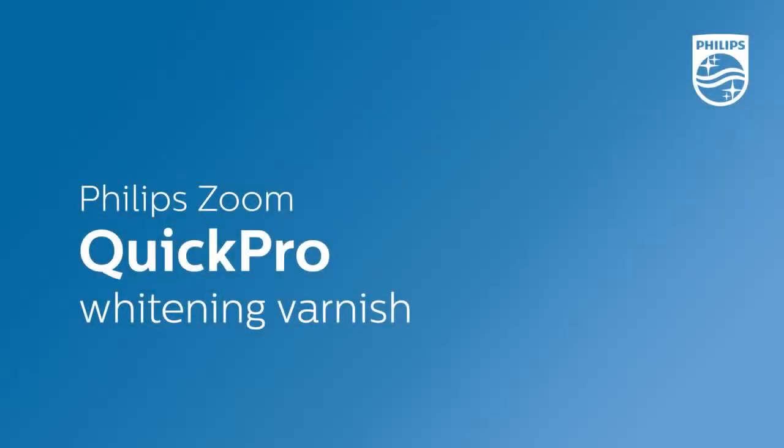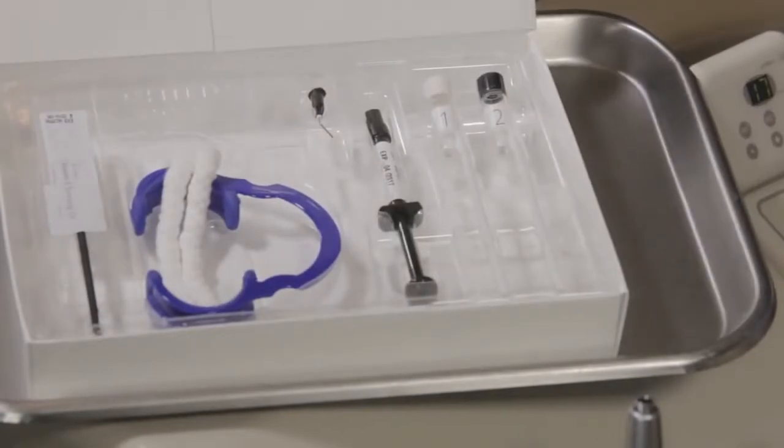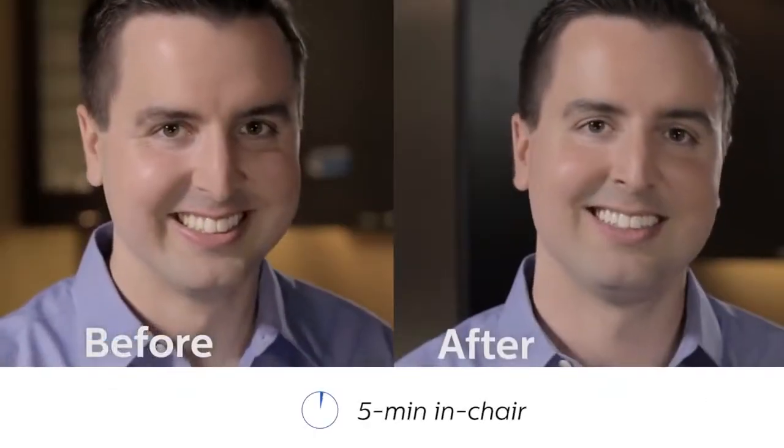Philips Zoom Quick Pro is an entirely new way to offer patients professional whitening results in minimum time. It utilizes a breakthrough two-layer technology that whitens teeth by four shades but takes just five minutes to apply. Because of the quick application time and innovative sealant layer, Philips Zoom Quick Pro allows you to make whitening a part of nearly every patient's regularly scheduled appointment.